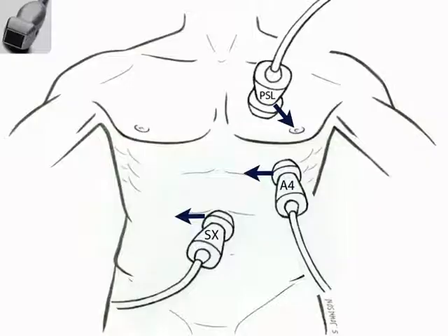legs. So recall that last year when I came to you, we talked about the different locations to point the probe, and the one way is here against the parasternal long axis. This is where, as its name suggests, parasternal, para means next to, sternum. You place it right along the edge of the sternum and you aim the indicator down towards the patient's left, somewhere between if their arm was at their side, it would be their left elbow or their left hip, in this kind of direction this way.